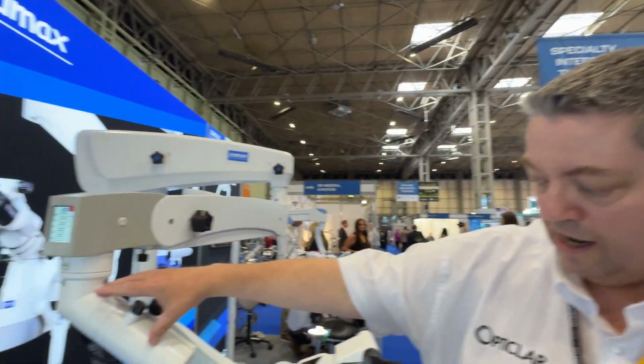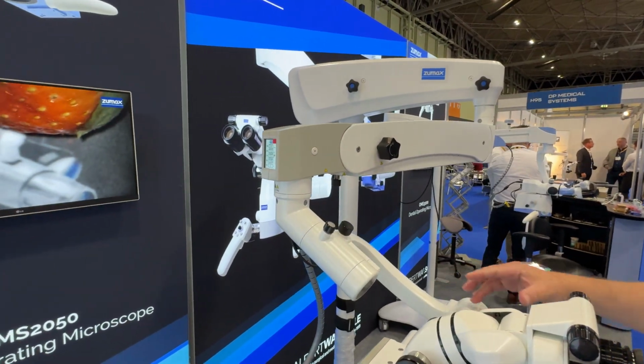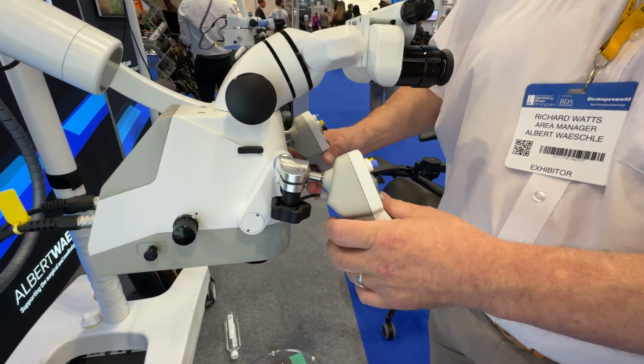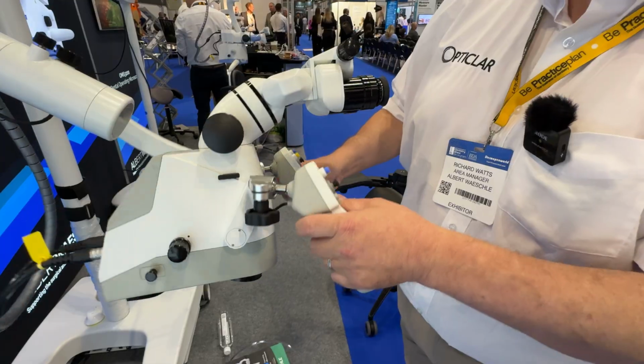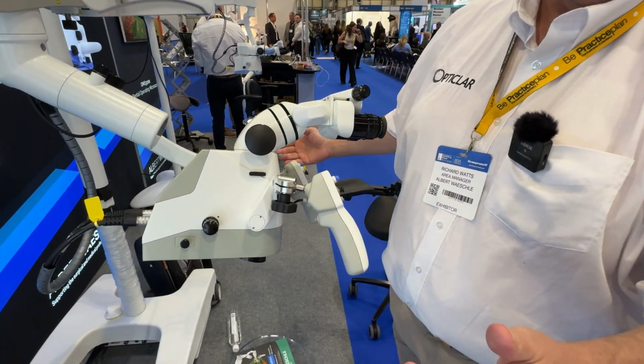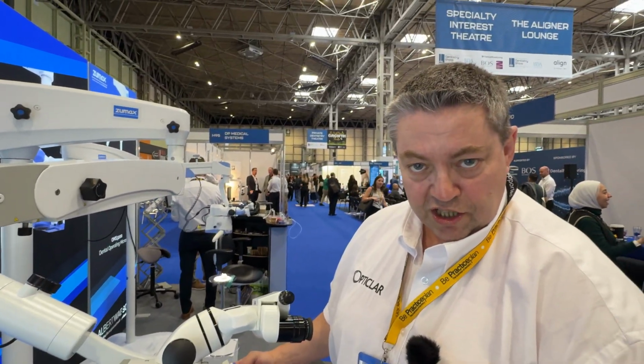Okay, so this is the OMS3200. It comes in two main models. You can get the OMS3200 R2 or the OMS3200 Pro. And the difference is the electromagnetic brakes. So this version has 3 electromagnetic brakes that control the movements at this joint, that joint and that joint. There are buttons behind the handles. When you press that button, this goes really floppy, so it'll move around as light as a feather. And the moment you take your fingers off those electromagnetic joints, it freezes in place.